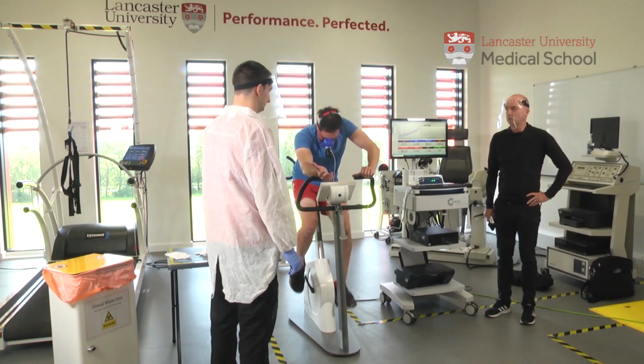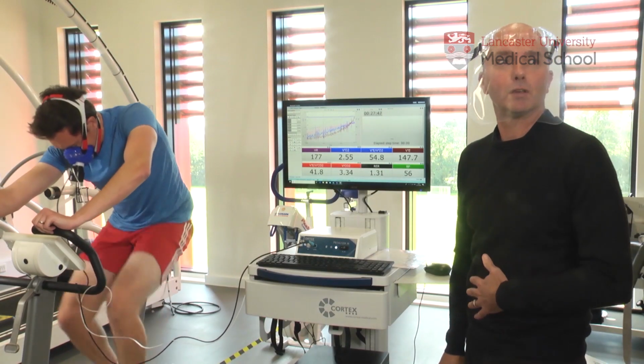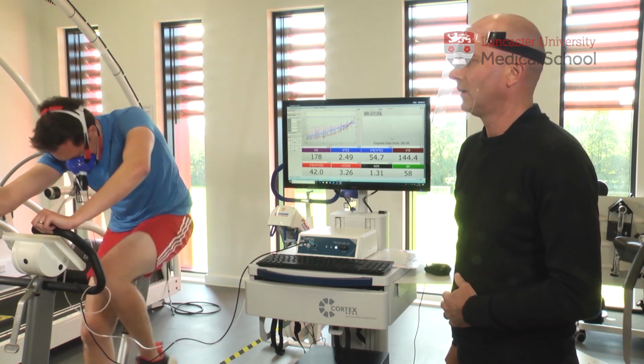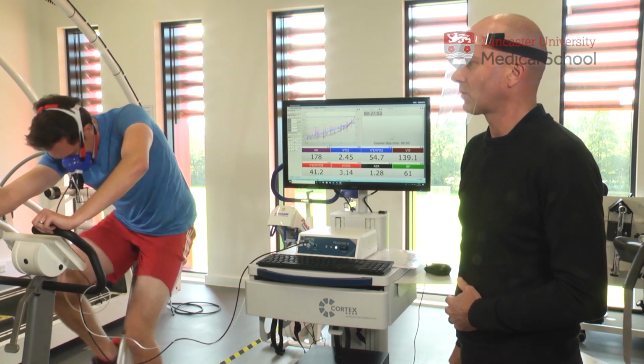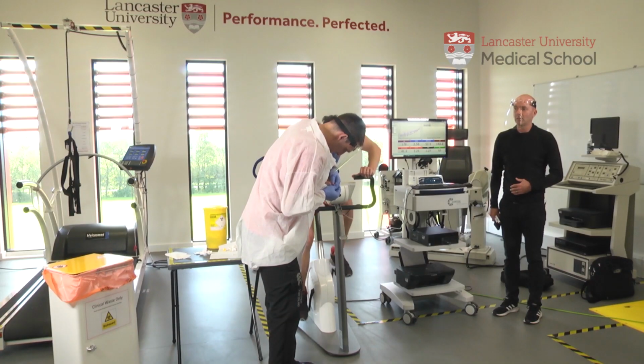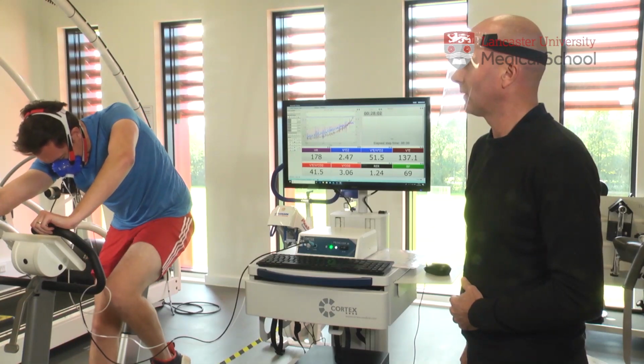Last 20 seconds of the test, the final lactate reading is being taken. The previous one was 6.92 millimoles per litre. So Chris is taking his last one. Jack's taking the last reading from Chris. That's it. Well done, Chris.